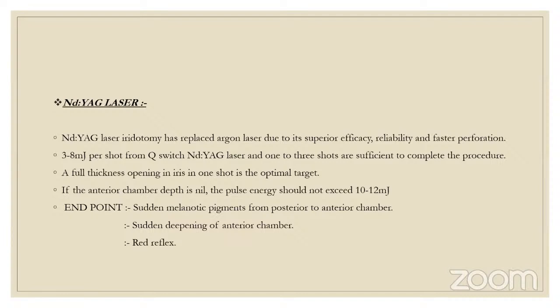You can also change the offset in microns, say 150 or 300 microns, or 125 for an anterior offset. For YAG PI, we don't use offset, which means wherever the aiming beam is, the laser will be fired at the same place. For YAG capsulotomy, we use the posterior offset. When we focus on the posterior capsule, the laser is fired behind it, so we don't get lens pitting. Here we don't use offset. If you use posterior offset for PI, you may not have adequate power delivery at the iris plane.